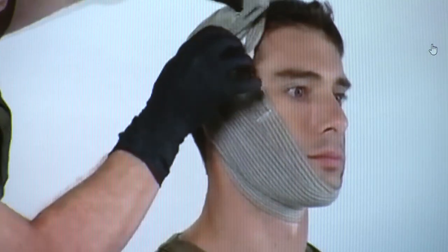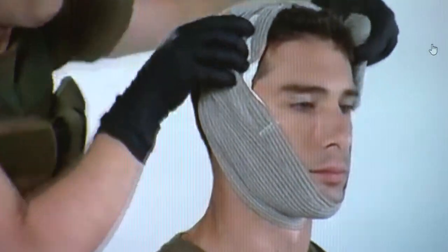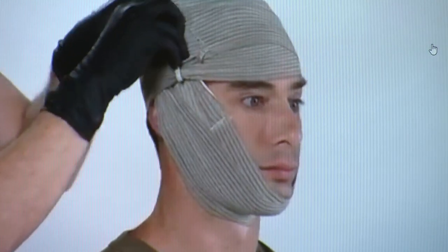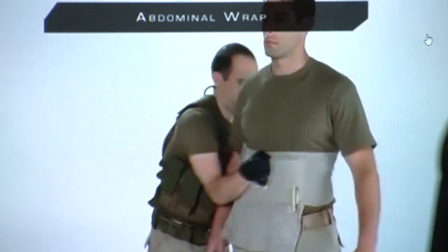Insert the cloth leader into the space between the pressure applicator and the patient, and now begin to wrap head and chin. Having that bar there to be able to change directions really frees you up to do whatever you want. Place the pad on the abdominals the same as all the others.